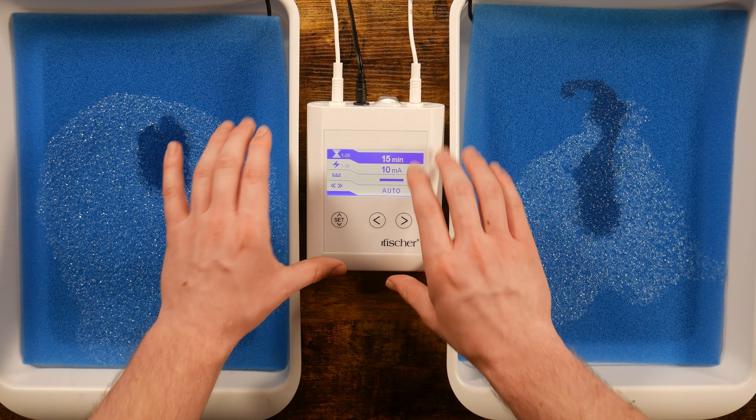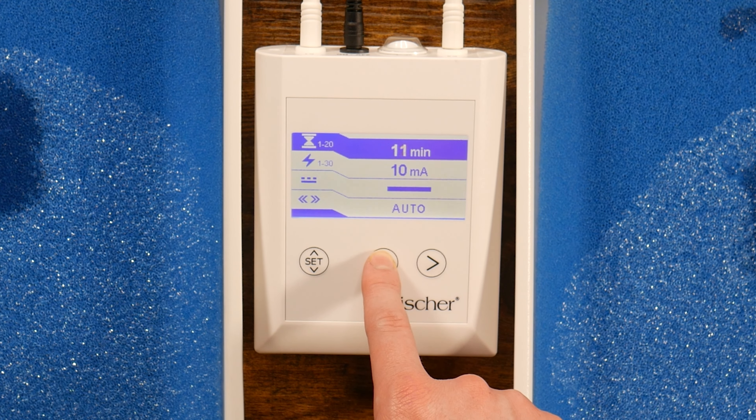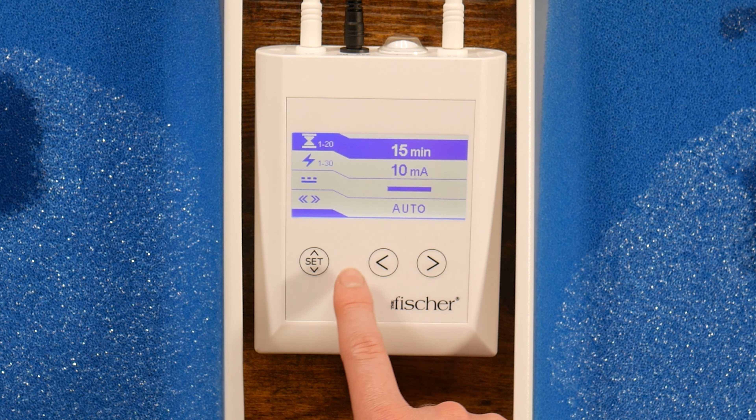On the top of the screen, you can adjust the duration of your treatments. Press the left and right arrows to change the time accordingly. Your treatment specialist will have already sent you your treatment settings to use. After selecting your treatment time, press the Set button.